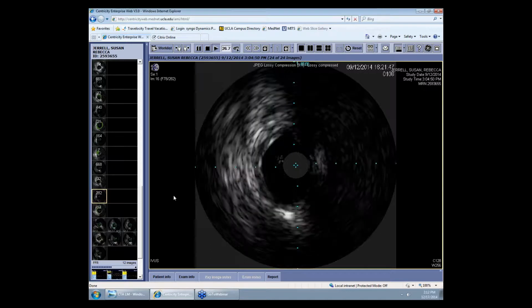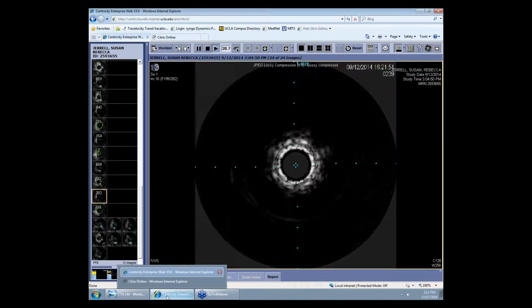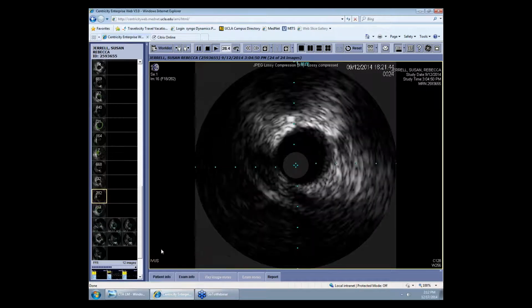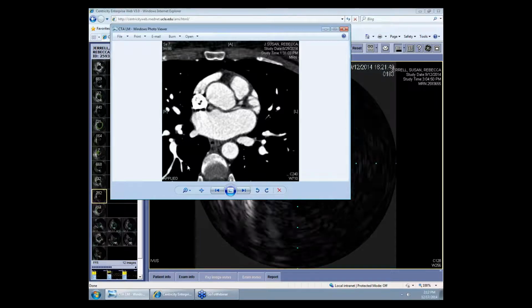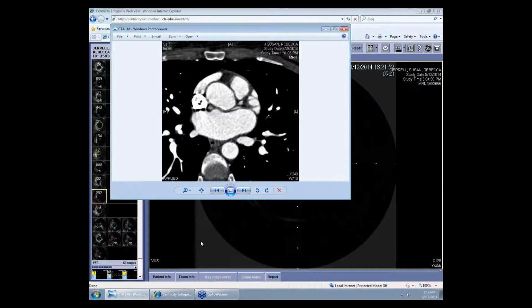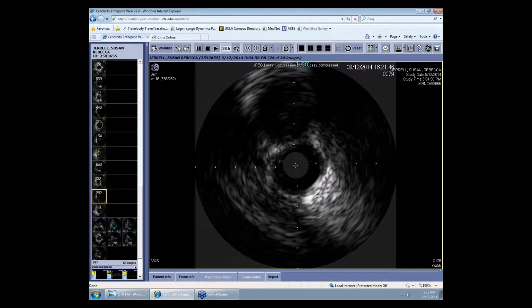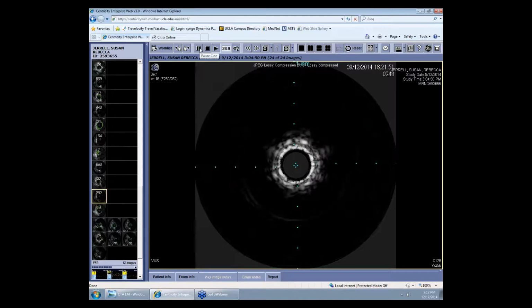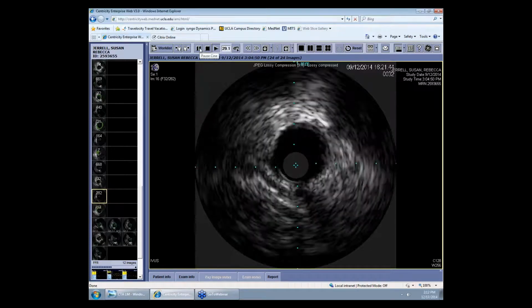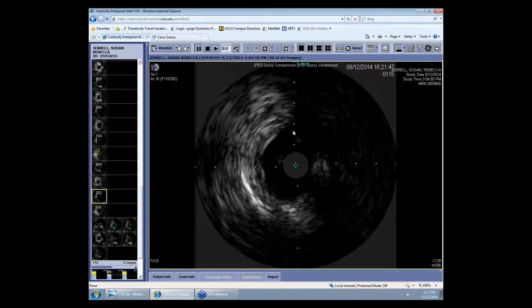John, do you hear me? Yes. Then I think there is hypoplasia. In the very beginning of the artery, you see this. It's about 2.5 diameter. On the ultrasound, you want to stay on that? Yeah, if you want, you can entertain the idea that the proximal is more compressed, as in the usual case of intramural coronary artery. It's hypoplastic. You see, this is 2.3, for a left main is very small.